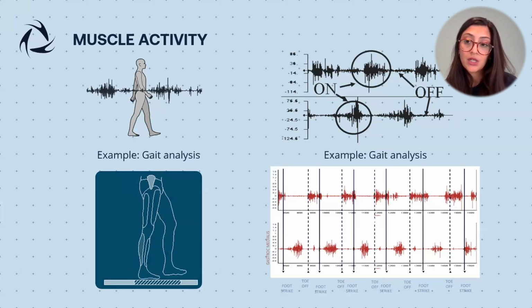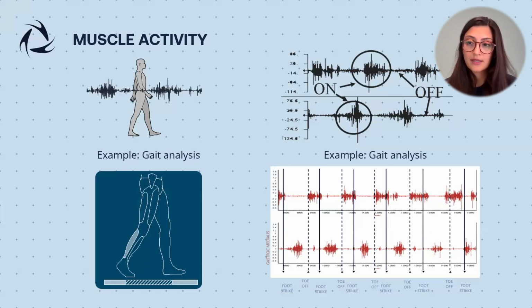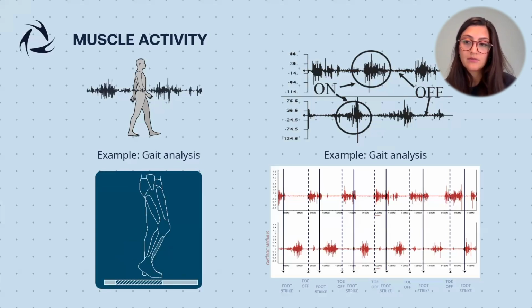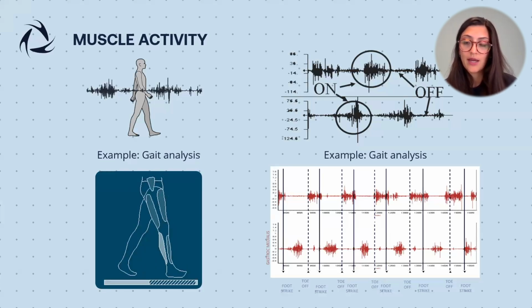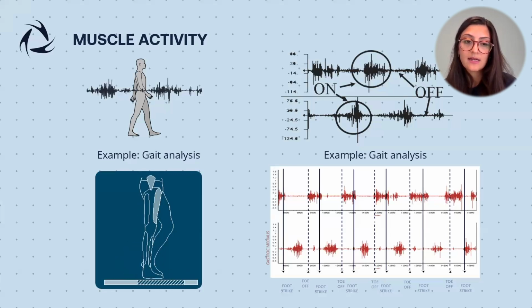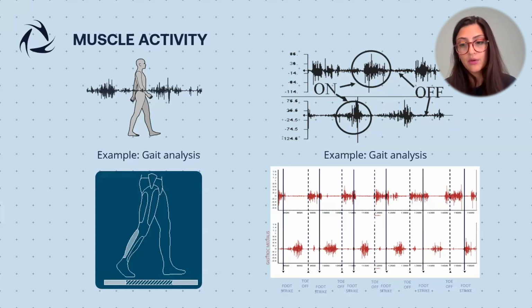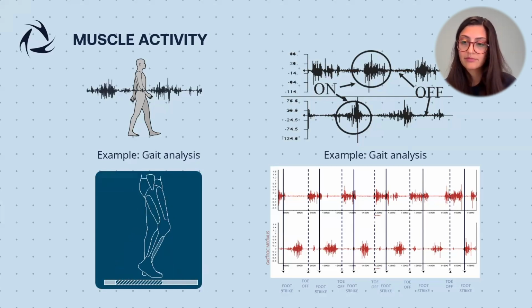So from an acquisition, it is possible to understand if the muscle contracts and even to quantify the amplitude of this contraction. The system can also be used to visualize the real-time on-off state of the muscle, so if the muscle actually contracts or if it's relaxed, since the visualization of the EMG signal is in real time while starting an acquisition. So it can also be used for a sort of biofeedback test.